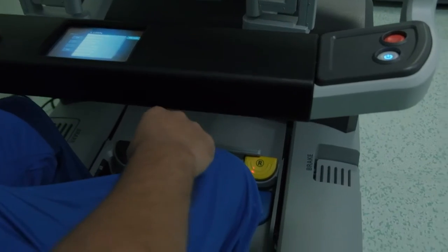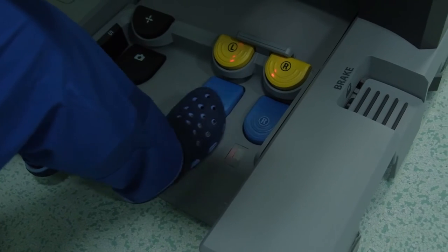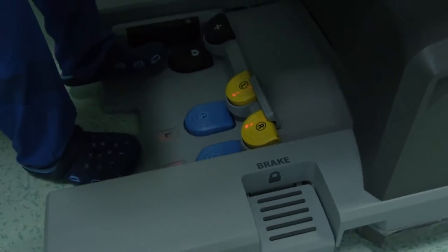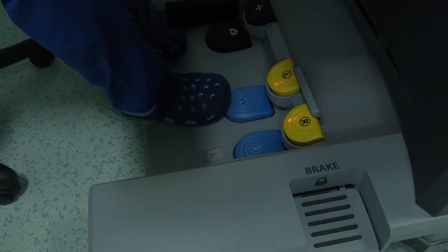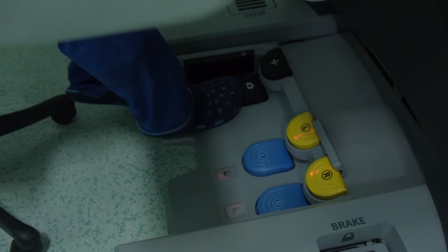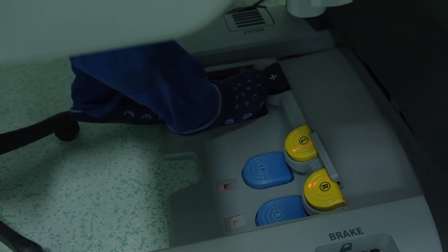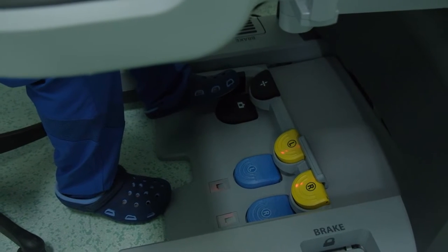It has the foot pedals. These are the energy pedals for the right instrument, the blue and the yellow, and the energy pedals for the left instrument, the blue and the yellow. The camera pedal is used to control the camera movement. The clutch pedal is used to clutch the master controller, or the hand controls, and the swap pedal is used to swap between the various instruments.